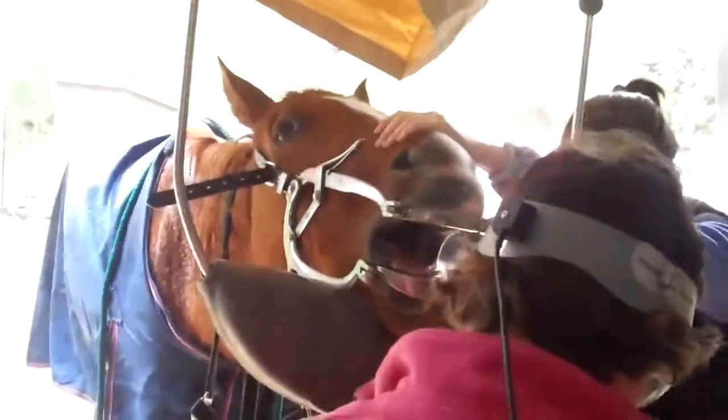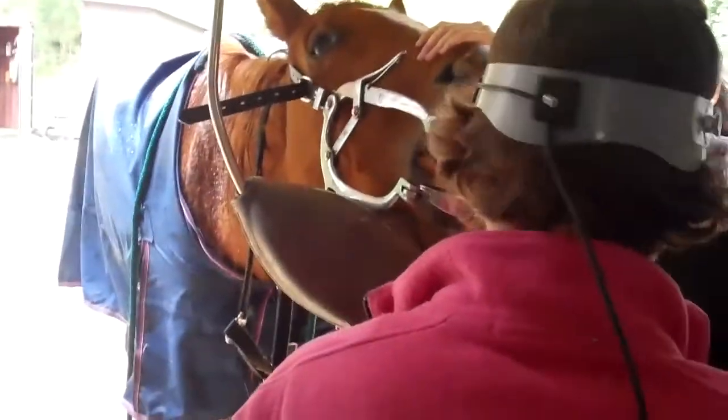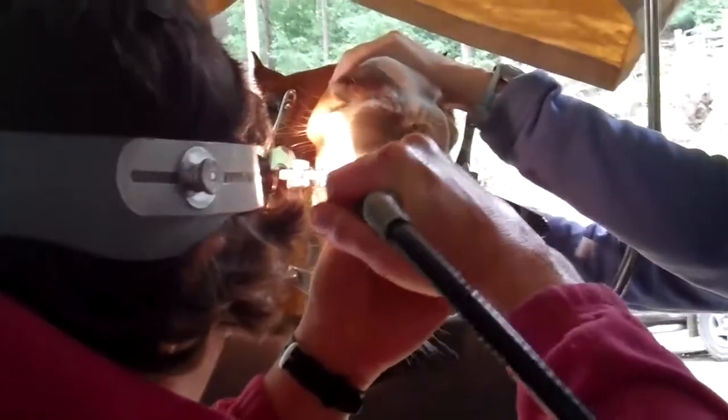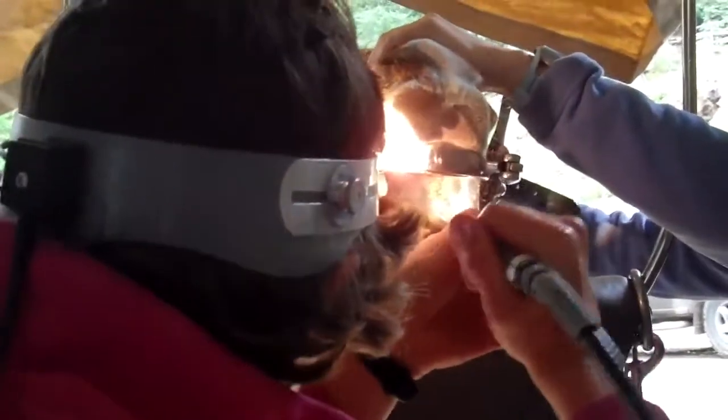Now safety glasses go on. This is our next test of sedation level. Zero. Good — doesn't seem to mind at all.